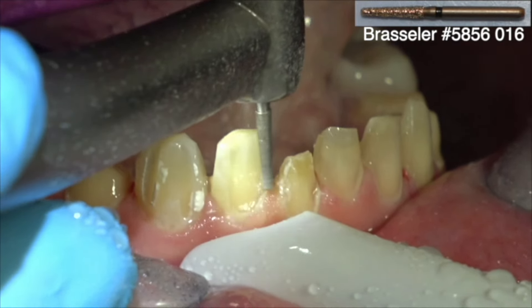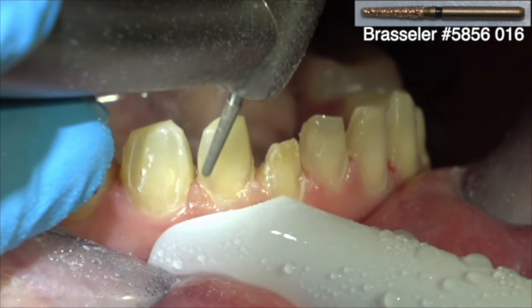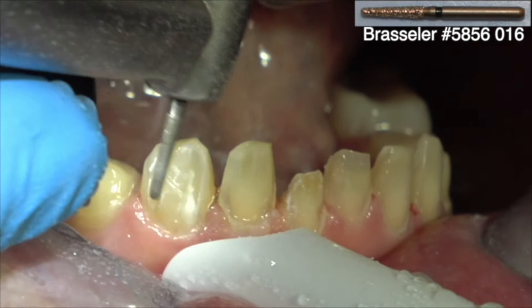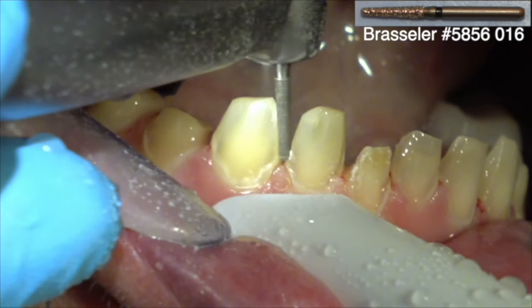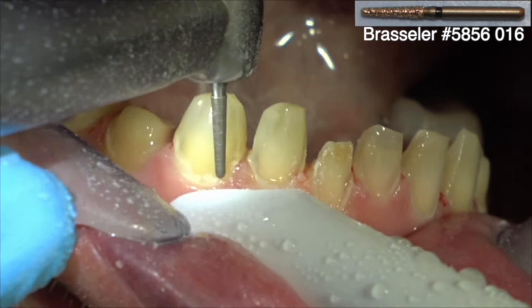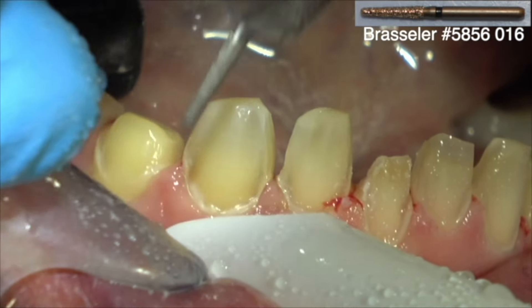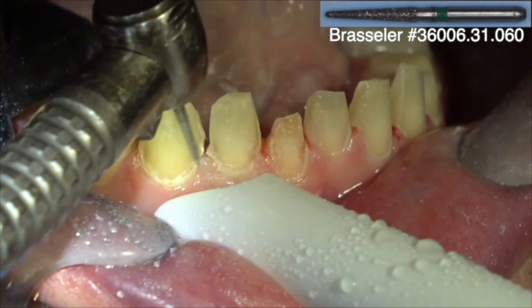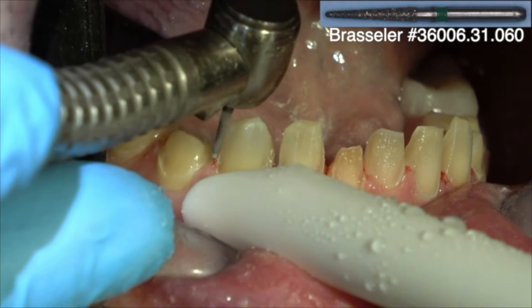Especially if they're an older patient, they may be unwilling to do that, so see if there's another option. Endodontics may be a practical option. I spend a lot of time looking at the preps occlusally with either the skinny mirror or the fat mirror to be sure that all the preps will draw.